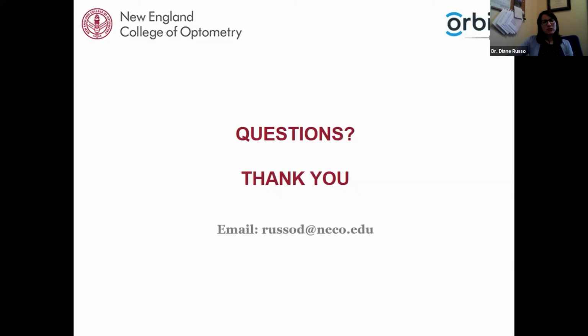Which type of retinoscopy is good for student practice, the spot or the streak? That is also a good question. I don't know if there's really a difference for student practice. I've used both. I mean, predominantly I've used the streak, but I've also used the spot. The spot I have found to be much less common just in my practice, but when I did use it, I found it to be very helpful. I found it to be easier in finding the principal meridia. I don't know if there's a hard and fast rule for one versus the other.